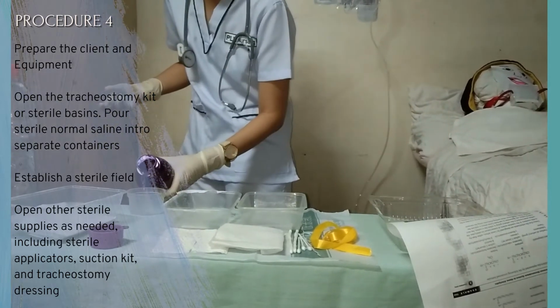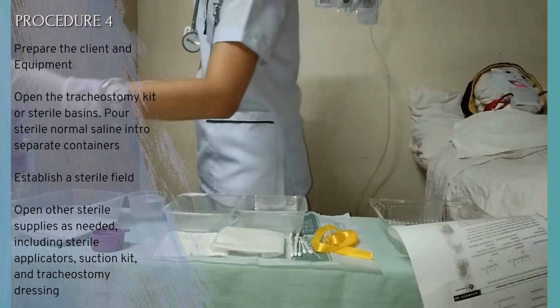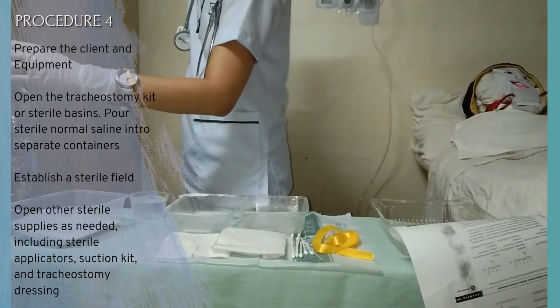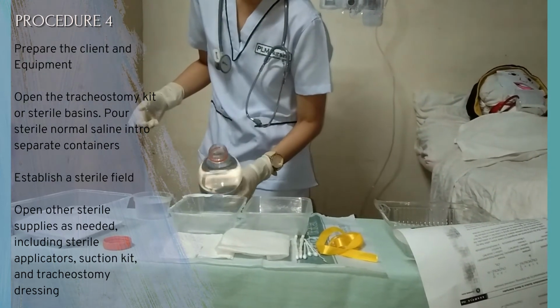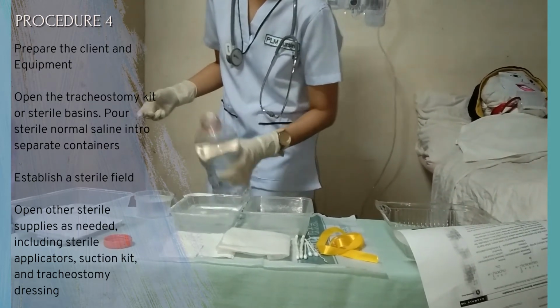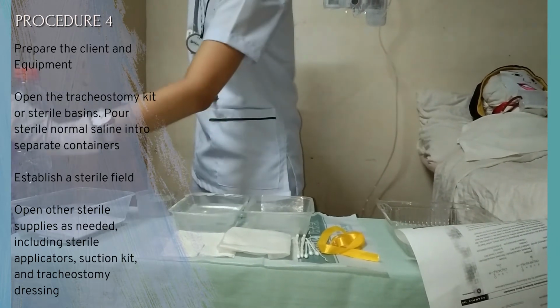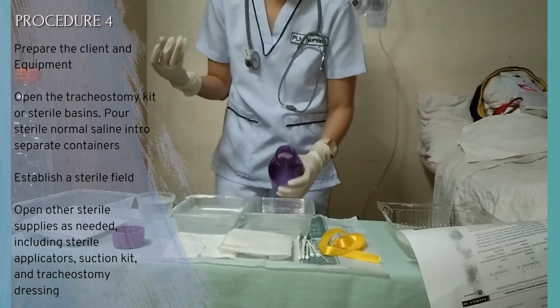Now we have to put the solutions in the containers. This will make my non-dominant hand not sterile. We put hydrogen peroxide on the first container of the tracheostomy kit to loosen the secretions of the inner cannula. The second container will have normal saline solution for rinsing, and the third container will also have normal saline solution for cleaning the incision site and the flange.